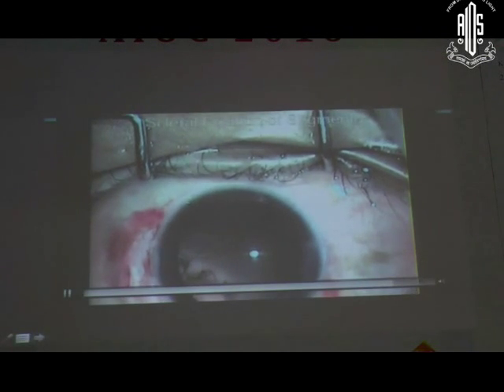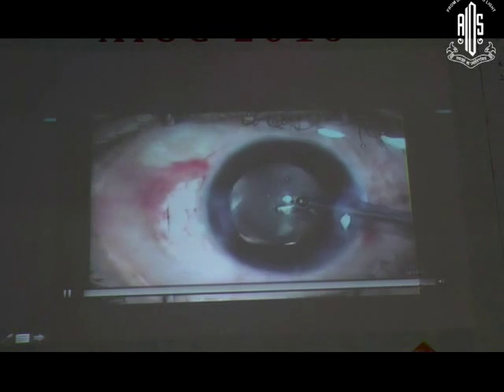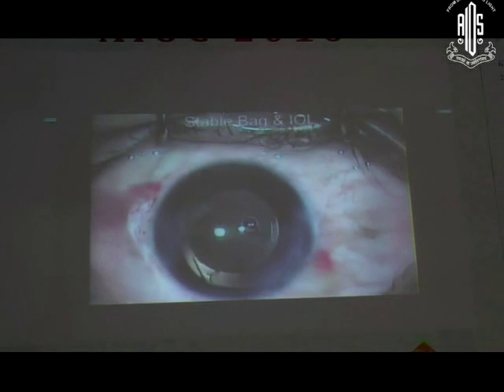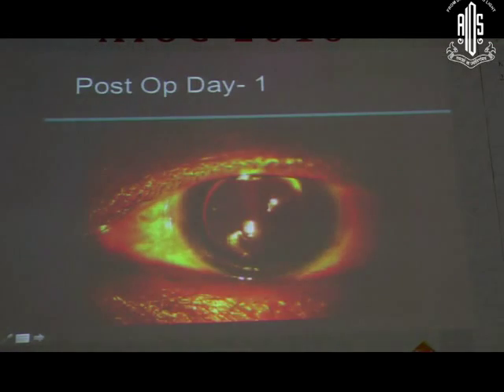And after this, the IOL can be implanted in the bag, which is secured, and the advantages of IOL in the bag cannot be re-emphasized. So these are the post-op pictures day one, with the patient having a vision of 6/12 partial, and thank you.